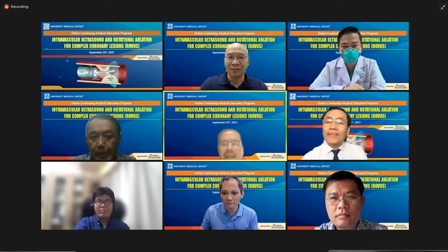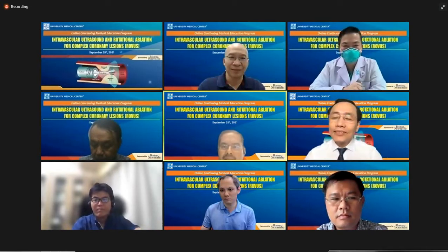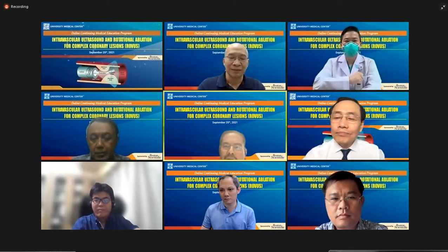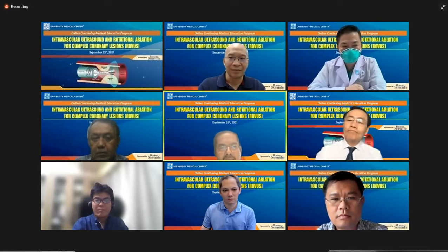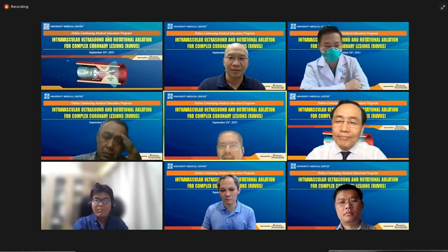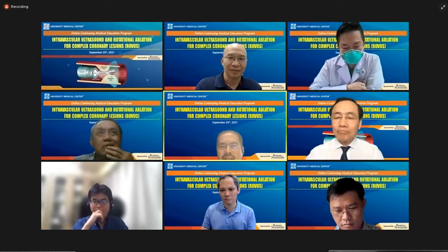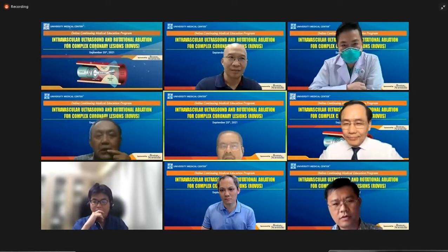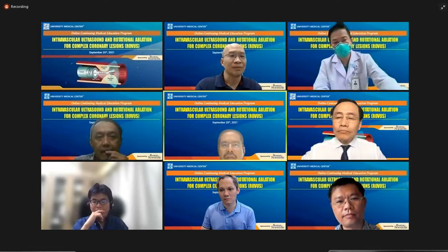Thank you very much for the great talk from Dr. Kuramitsu. I think that the evaluation of side-branch occlusion is very crucial for bifurcation PCI, and it's important to identify the three key factors Dr. Kuramitsu mentioned in his lecture. However, I have one question for Dr. Kuramitsu.